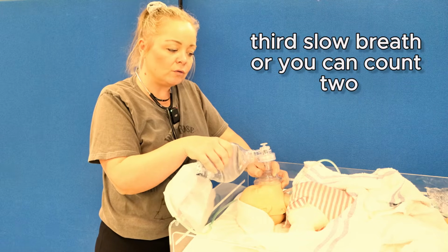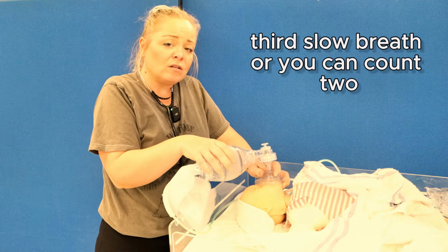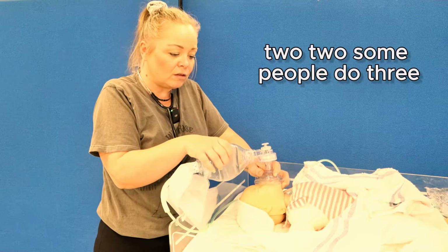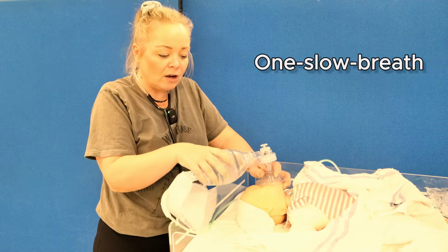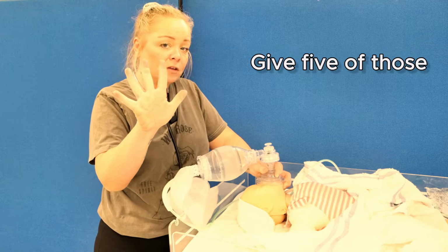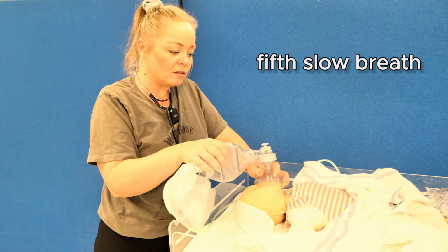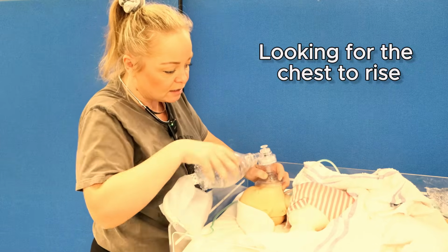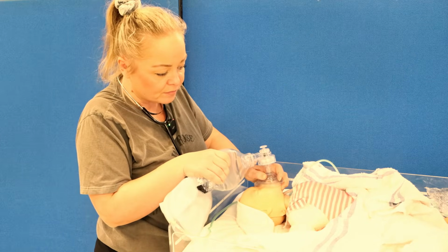3rd slow breath. Or you can count 2, 2, 2. Some people do 3, 3, 3. I like to say 1 slow breath. But you're going to give 5 of those. 5th slow breath. As we're giving the breaths, we're looking for this chest to rise.